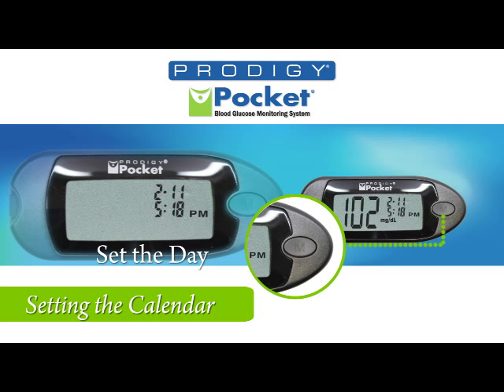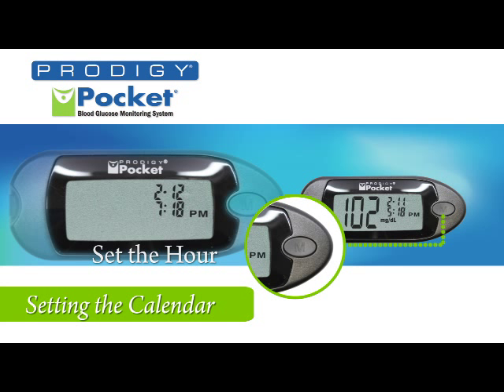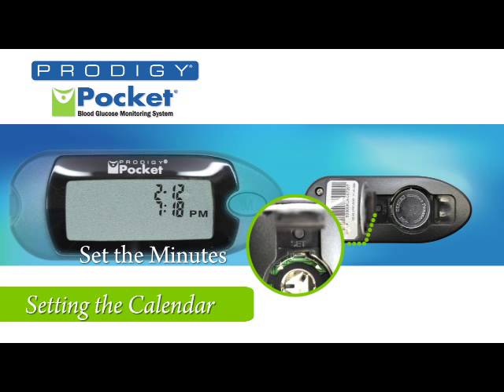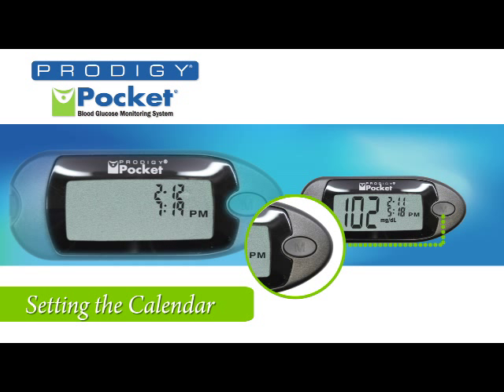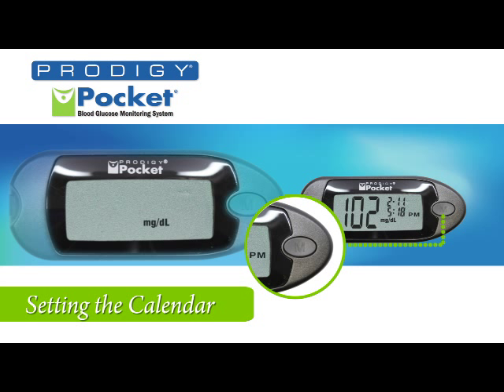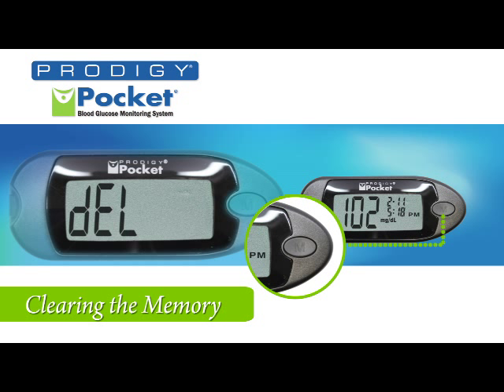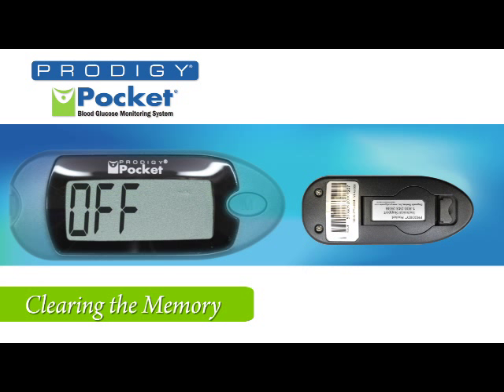Return to the front and set the desired date. Press the set button to set the hour, then press the M button for the desired hour. Press the set button to set minutes, then press the M button for desired minutes. Press the set button to set the unit of measurements. Press the M button to choose the desired unit — milligrams per deciliter for American or millimoles per liter for Canadian. Press the set button one final time. If you want to clear and delete all records, press the M button. If not, simply press the set button one more time and the meter will shut off, retaining your information.